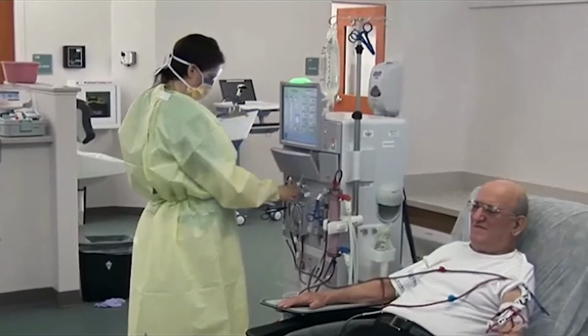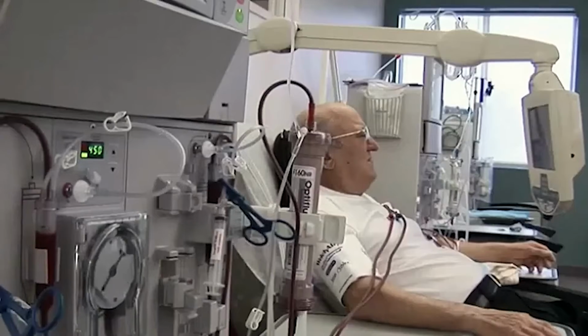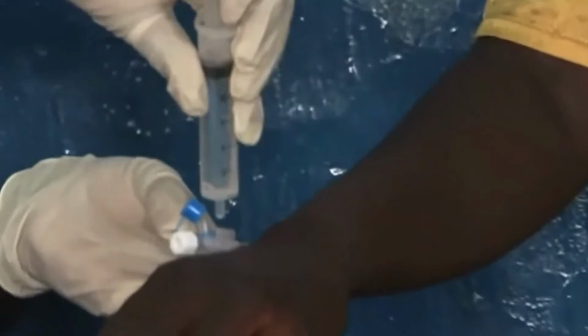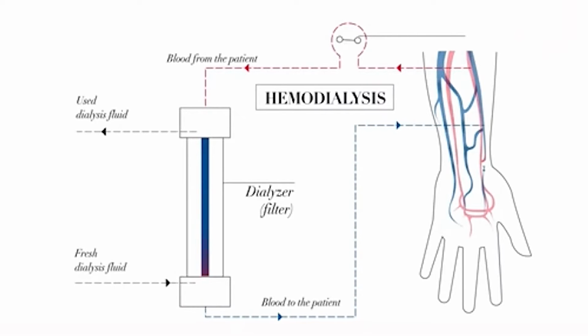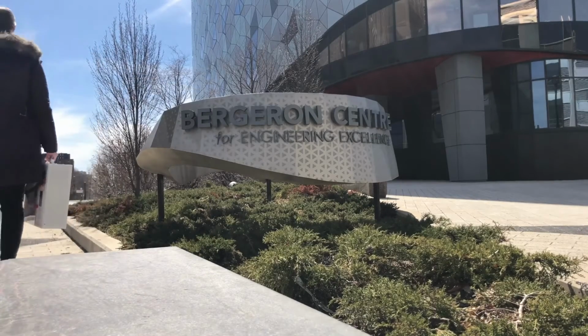Approximately 10% of the worldwide population of 7.8 billion people are affected by chronic kidney disease. People in developing countries are particularly impacted due to the lack of affordable dialysis machines, which is the main treatment option. Hemodialysis involves taking the blood from the body and applying a filtration process to alter the concentration levels of various solutes, replacing the role that is normally performed by the kidneys.